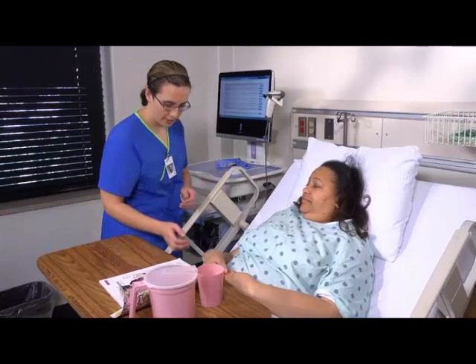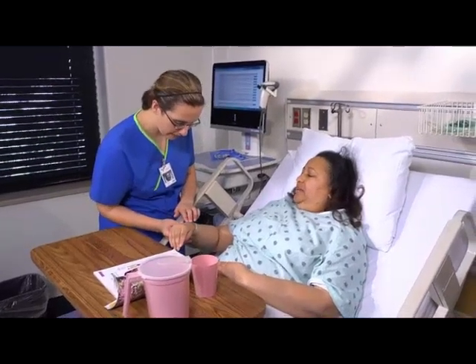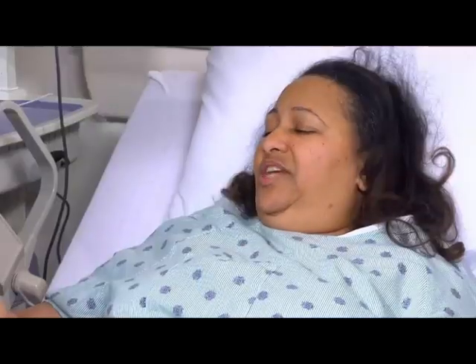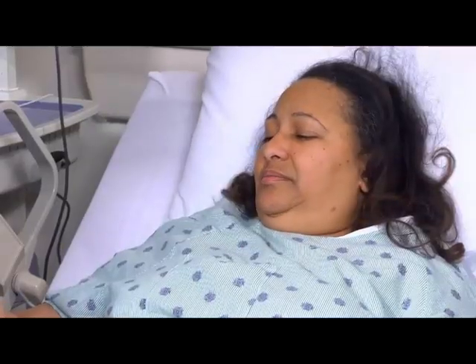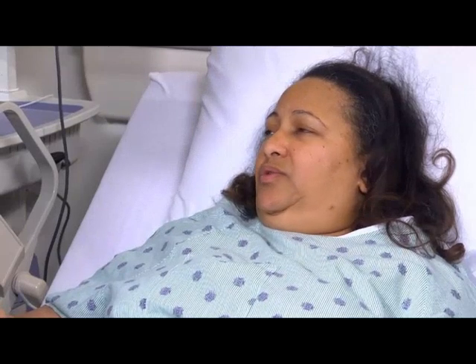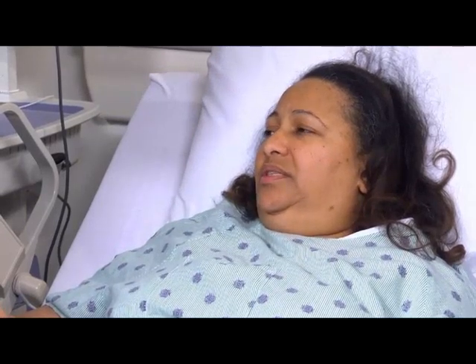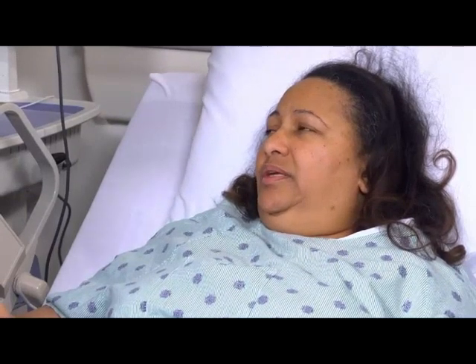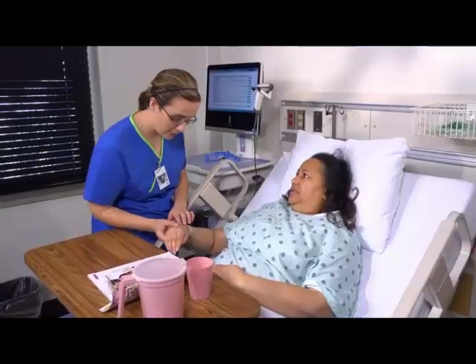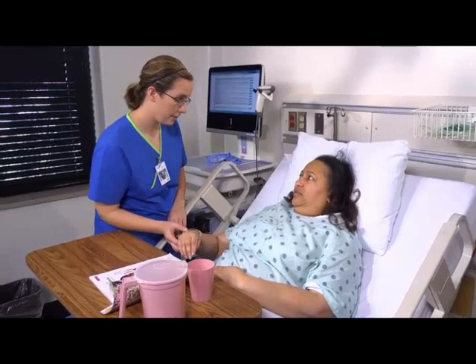I'm going to take a look at your wristband. Can you tell me your name? Marie James. And your birth date? 8-24-1963. Do you have any allergies? None that I know of.